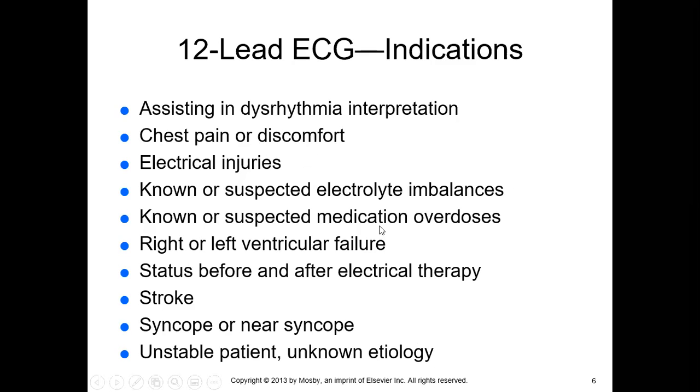So when a person has chest discomfort, electrical injuries, known or suspected electrolyte imbalance, known or suspected medication overdose, right or left ventricle failure, status before and after electrical therapy, stroke, syncope or near syncope, or an unstable patient of unknown cause, or any type of dysrhythmic interpretation, you may need to do a 12 lead EKG, which is why it's an indication for use. Okay.